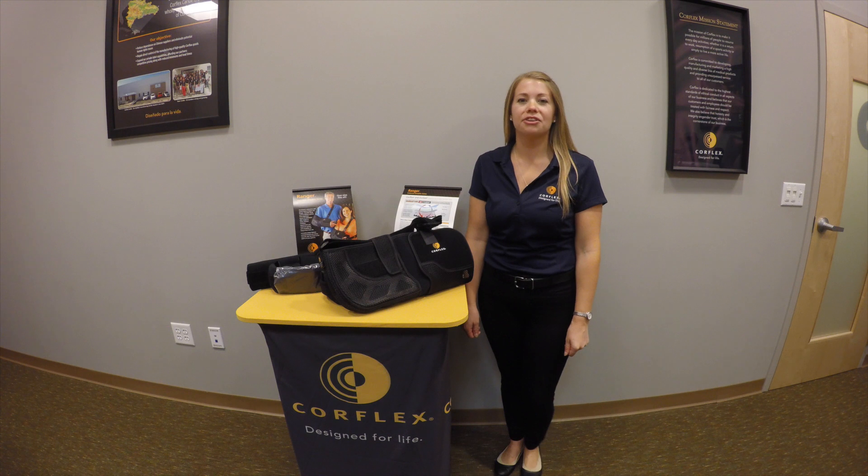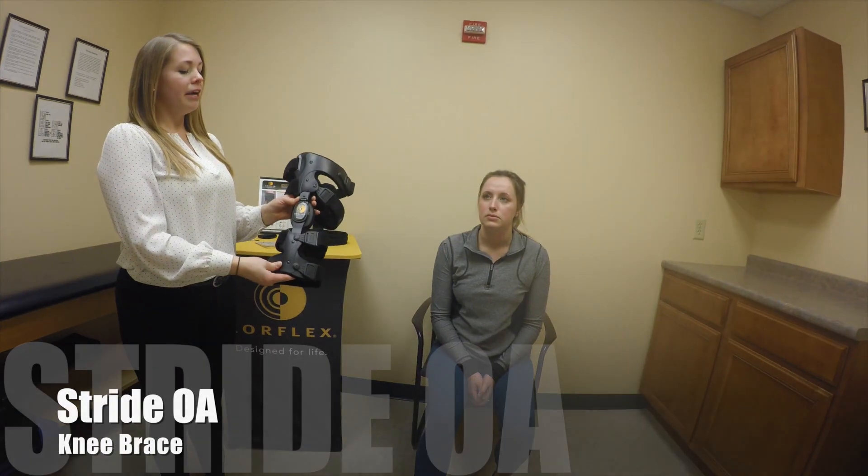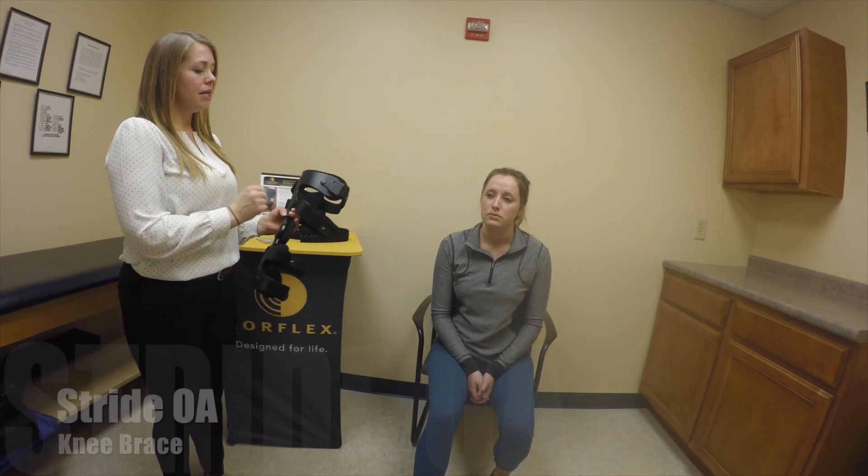Hi, my name is Diana. I'm a certified clinical fitter. Welcome to today's product video. When ready to fit your Stride OA knee brace, you'll detach all the buckles by pressing on the front.